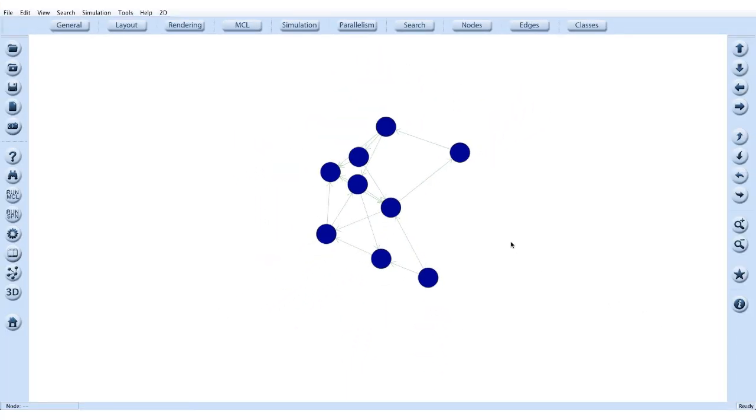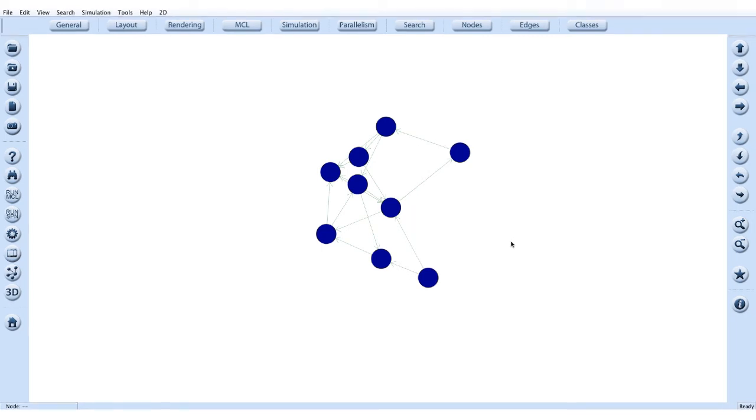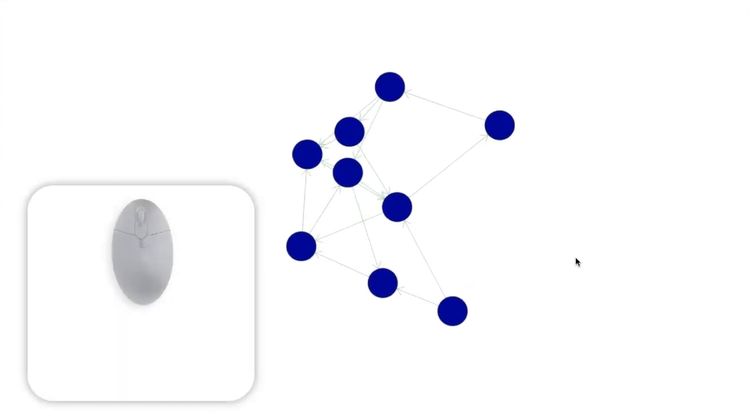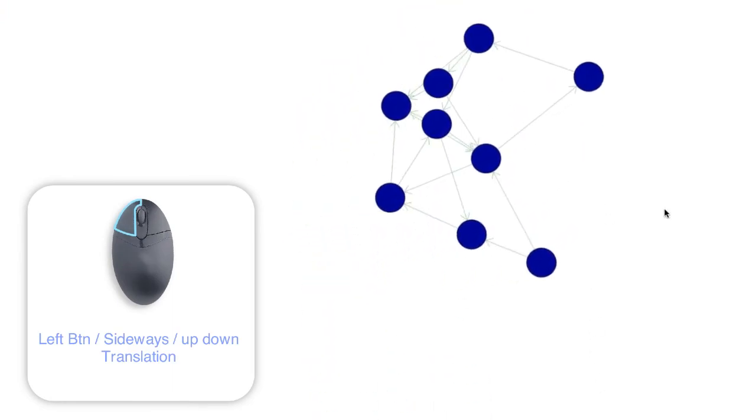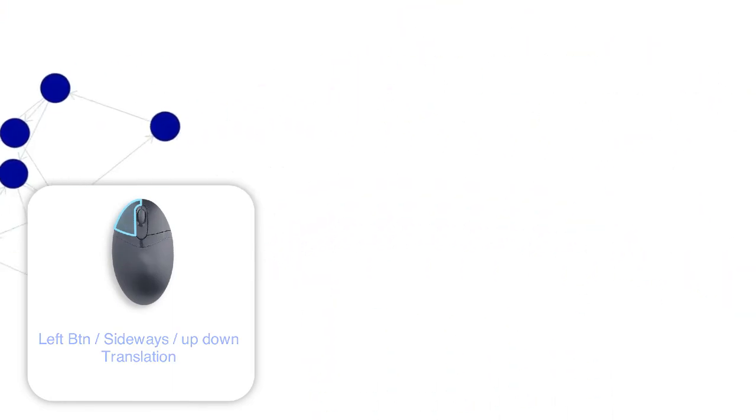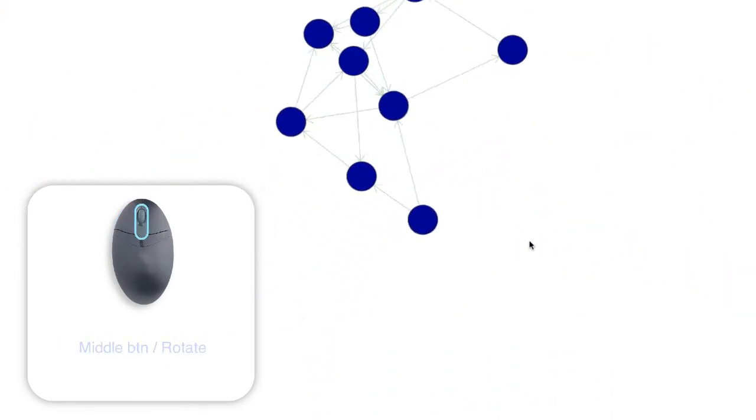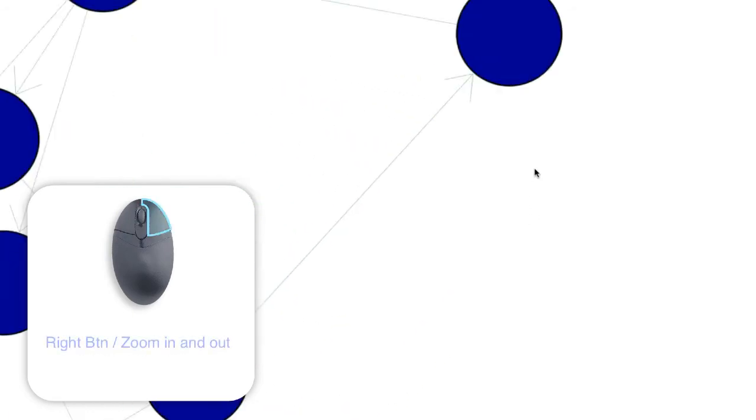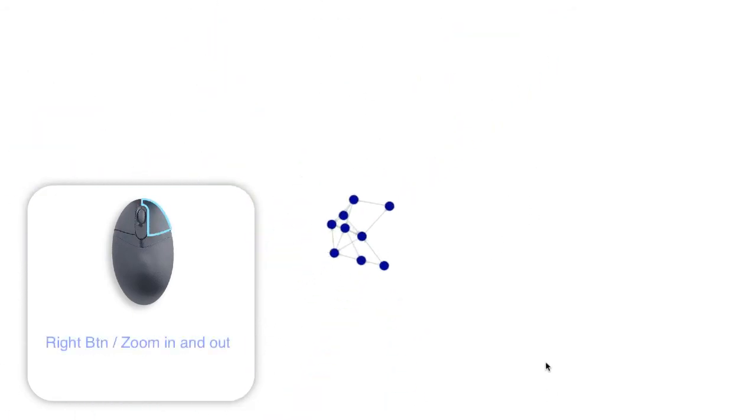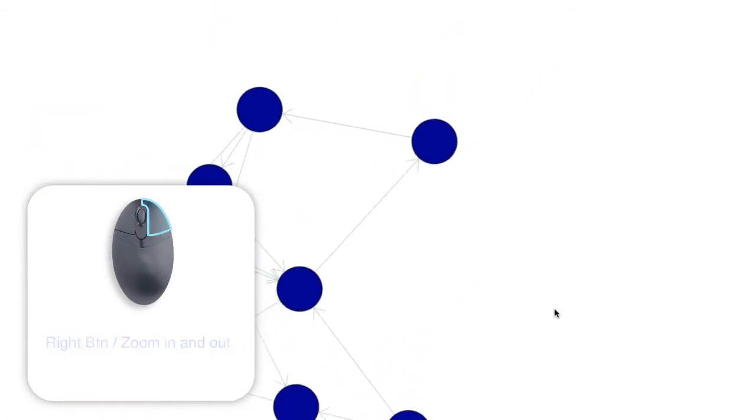We can navigate the graph in 2D much the same way as you would in 3D mode, although there are some differences. Here, pressing the left button moves the graph up and down, from left to right. The middle button rotates the view and the right button of the mouse zooms you in and out.